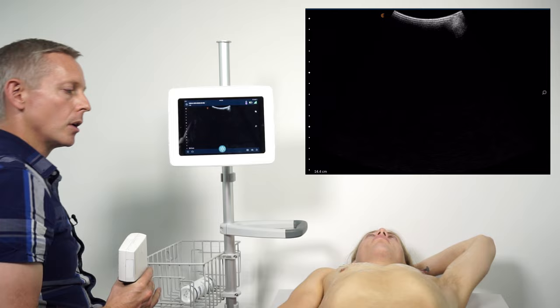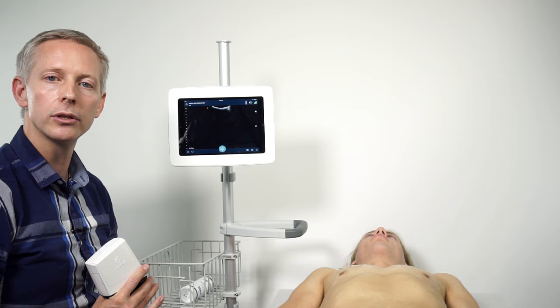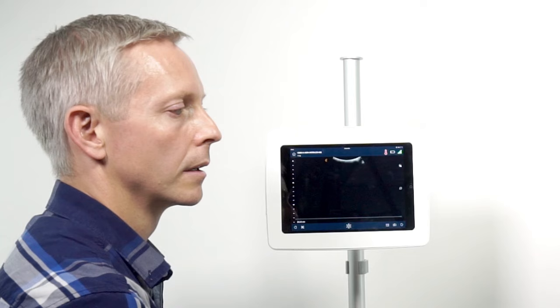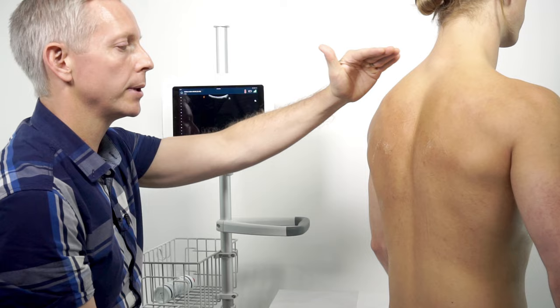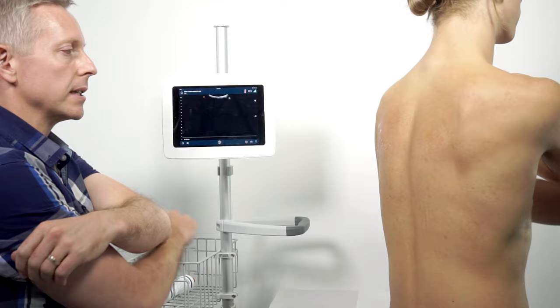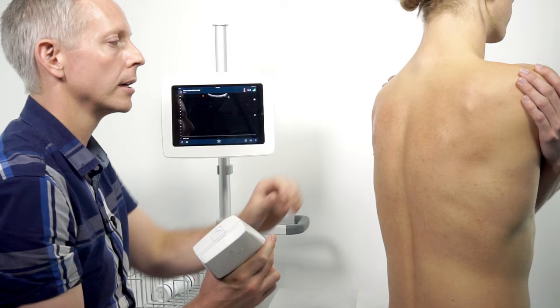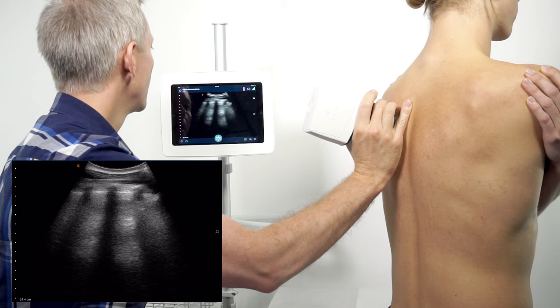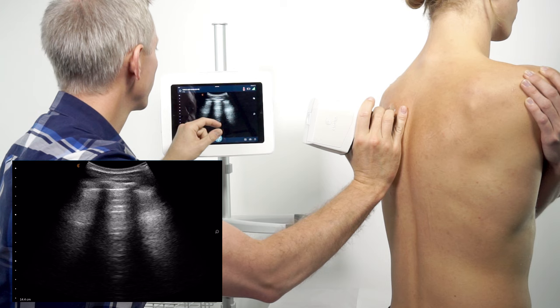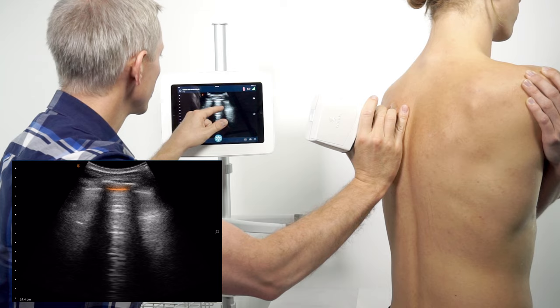Once I've scanned the anterior and lateral chest in the supine position, I want to move on to the posterior chest. The posterior thorax is divided by the midline at the spine and the posterior axillary line, again divided into a superior and inferior zone. To position the patient, I'll get him to wrap his arms around himself as if giving himself a hug. This pulls the scapula more laterally and frees up lung in the superior aspect of the thorax. Taking the transducer and orienting it up towards the patient's head, I'm looking for the rib shadows, the anterior surface of the ribs, and that nice hyperechoic pleural surface.